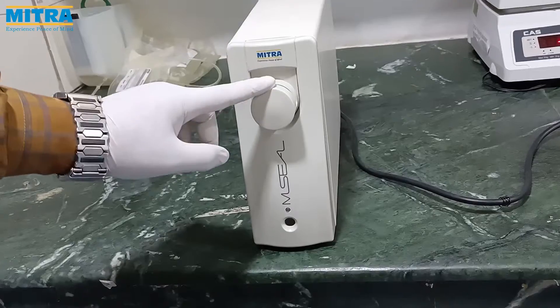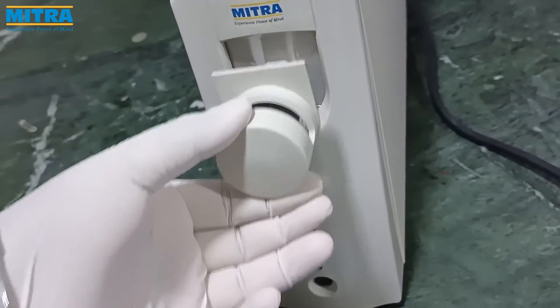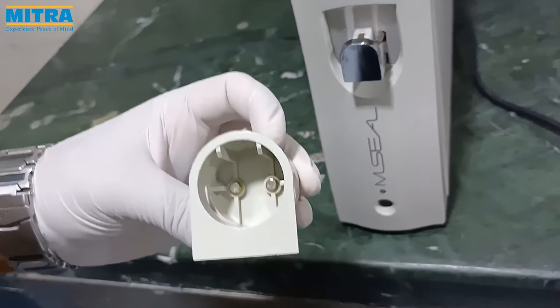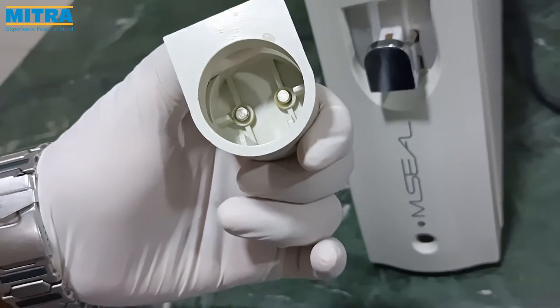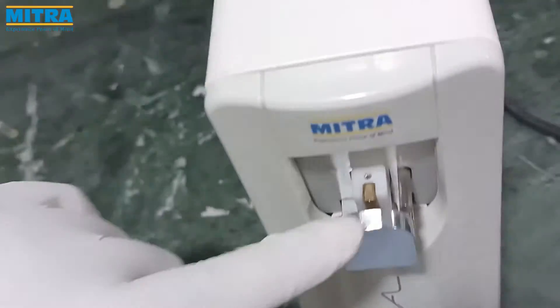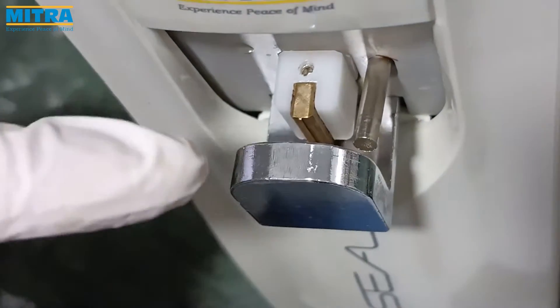This is the tube sealing head. It is covered with a splash guard which is magnetic and easy to remove and clean. The splash guard is made of tough grade fiber. This is the sealing head which generates RF for better tube sealing.